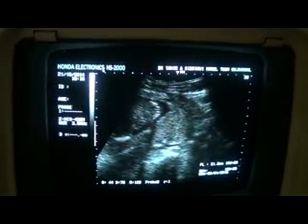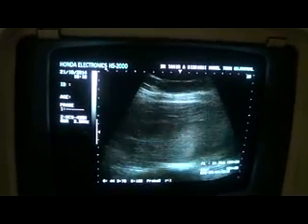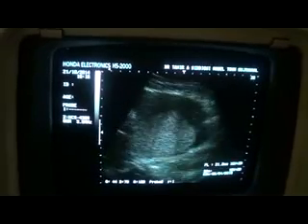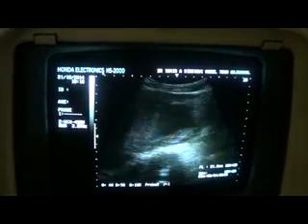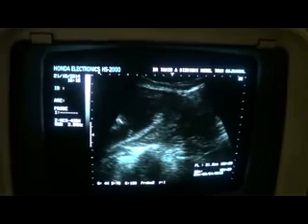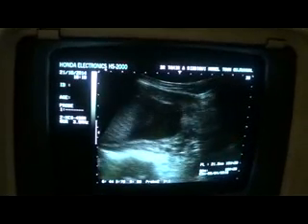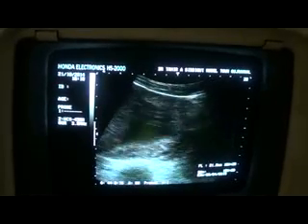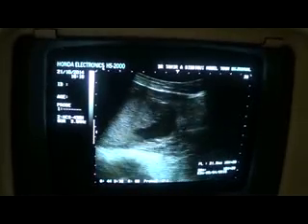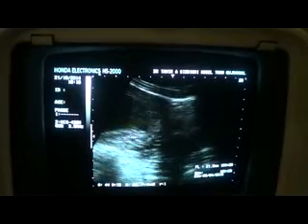This is the fibroid, and the placenta is on the posterior wall, but the upper segment, grade 2. The main important finding is that there is dilation of the cervical canal by the fluid that is being pushed from the upper segment into the lower segment, and that's the reason why only the cervical canal is visualized.